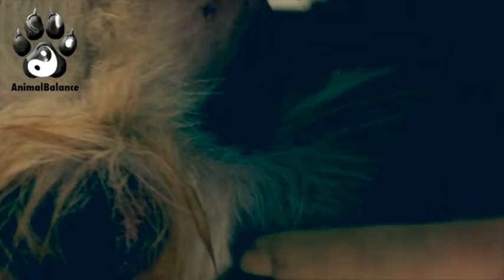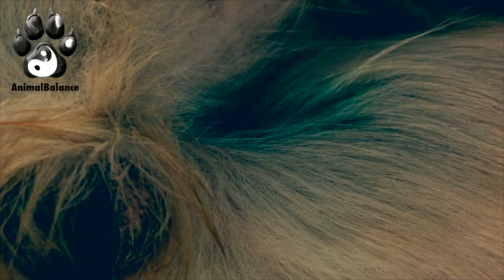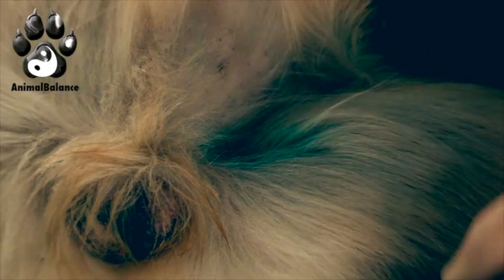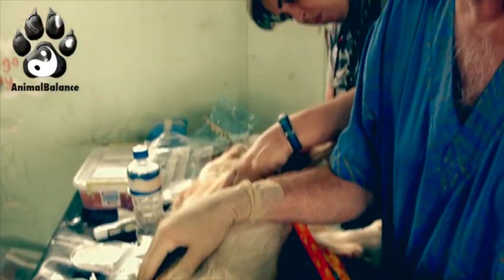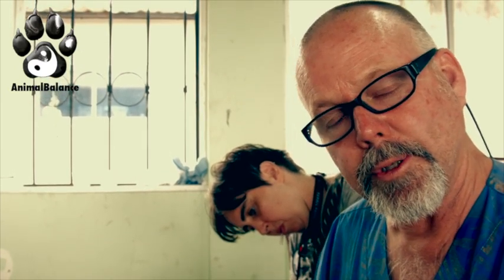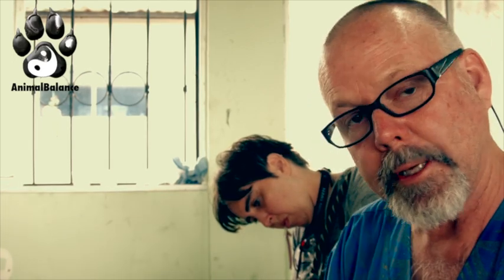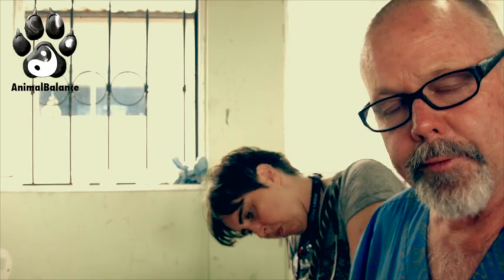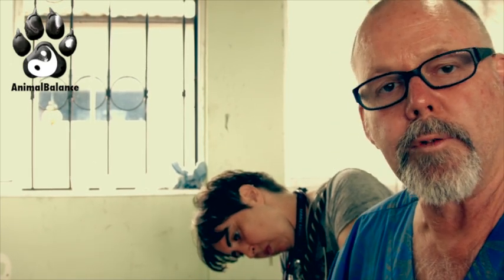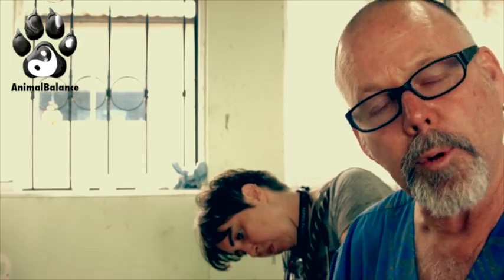He's now zinc neutered. I verify the mark and wipe it down to confirm a good cutaneous Z. The other important part of this procedure is addressing any discomfort — we give the dog a non-steroidal anti-inflammatory as part of the injection procedure and for a few days following, to make sure he's comfortable. We expect his testicles will swell and he'll have a different feeling, so we want to ensure comfort while the inflammatory process works to stop spermatogenesis — sperm production.